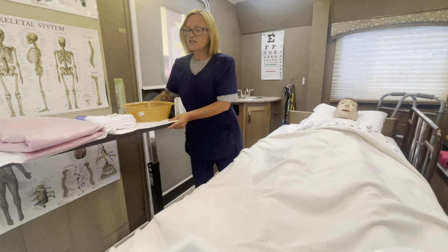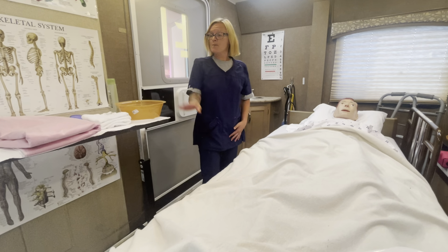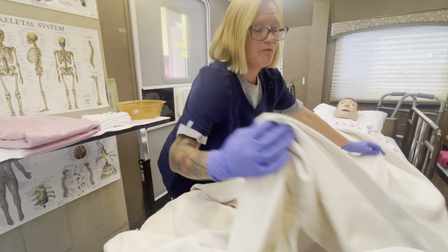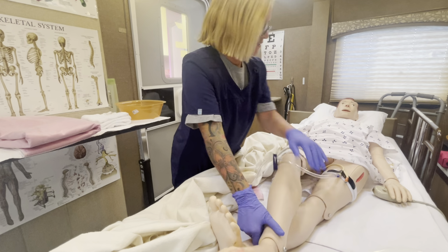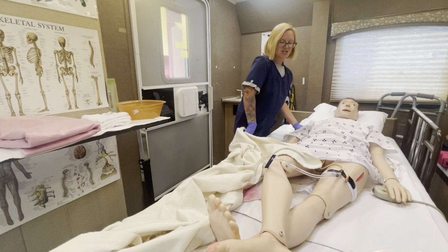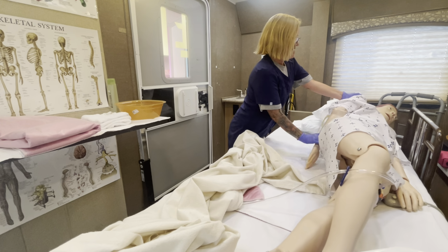The first thing we're going to do next is go ahead and put the pad underneath the patient. So I'm going to go ahead and apply my gloves. Then you can ask your patient, Ms. Smith, are you able to roll on your side? If she is, then she will go ahead and roll. And if she's not, then I'm going to go ahead and show you by removing the blanket so I can show you how I would roll my patient. And I would go ahead and cross their legs. I'm going to grab at their shoulder and at their hip. I am going to roll them to their side.